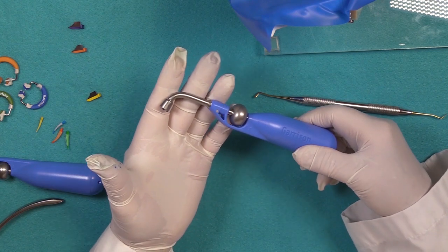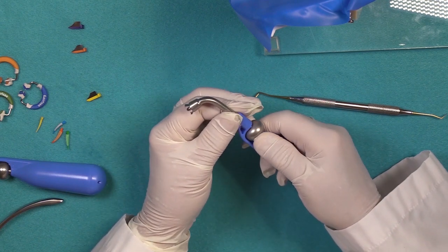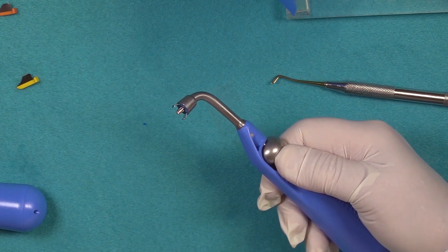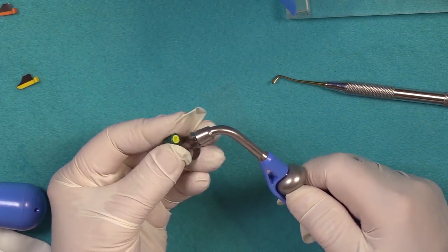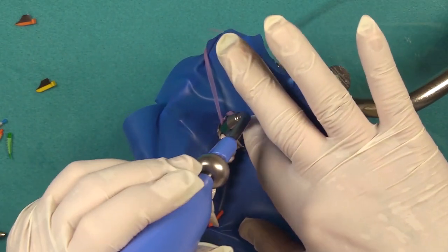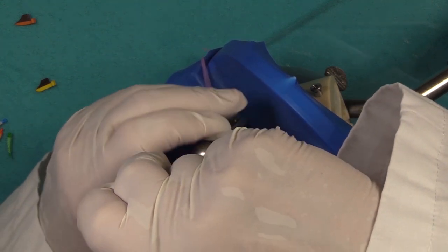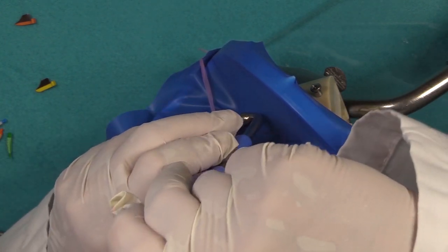When I first started to use this system, I wasn't sure how to use the applicator. What I found out is you have to press forward to open up the little prongs so that it engages into the real matrix system. Essentially, you're taking your matrix with the applicator in an open position and then clicking it into place. Engage your matrix system on the tooth, make sure you're seating it, and simply tighten the matrix system. Make sure your band is getting down where it should be seated, and tighten by turning clockwise, then disengaging.